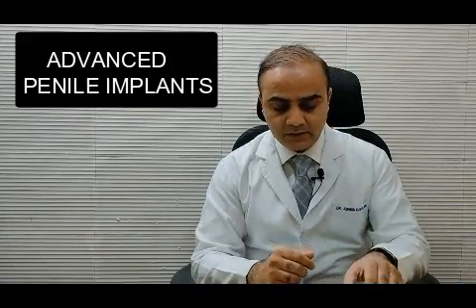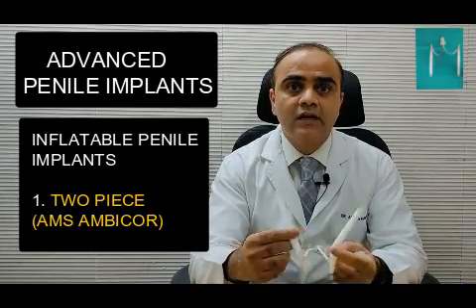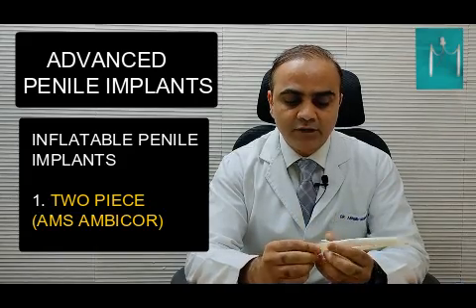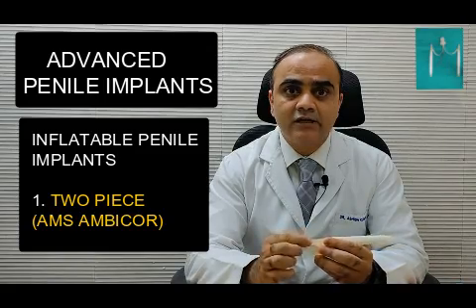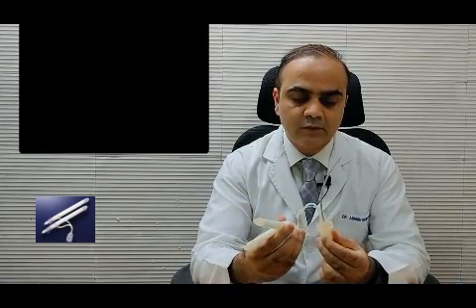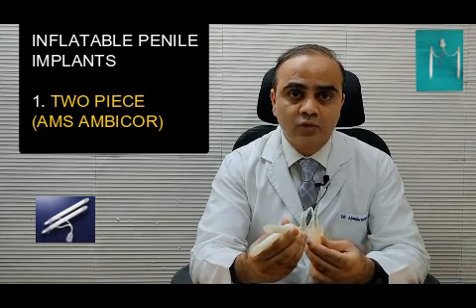So first of all, we'll be talking about the 2-piece implants. So this is the 2-piece inflatable implant device. In this, there are 2 rods. These 2 rods are placed inside your penis, and the rod size is basically measured by the size of the penis, and there are rear tip extenders where we see how much is needed. And in this rod there is a button. This is a button which has a reservoir as well as a button, and it is placed in the scrotum.